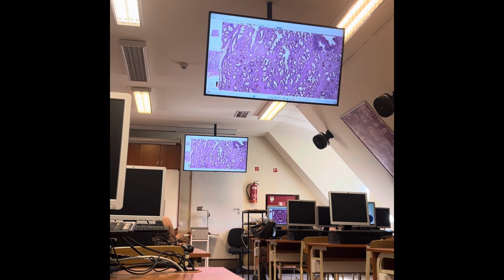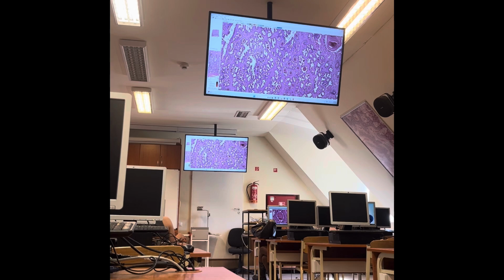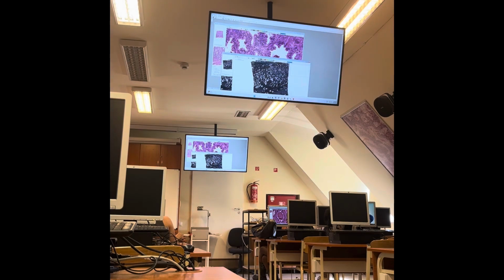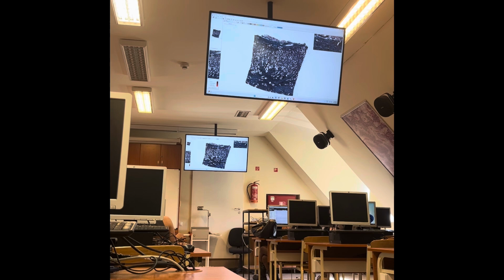Also in the main glands, you can identify these structures in the specimen. Many of the corpora amylacea you can see. Okay, so I come back here, and let's see the last specimen. That is again prostate gland, but with the Goldner trichrome staining. I don't know if you remember, we already had specimens stained by this staining. Trichrome means that there has to be at least 3 colors for the staining.